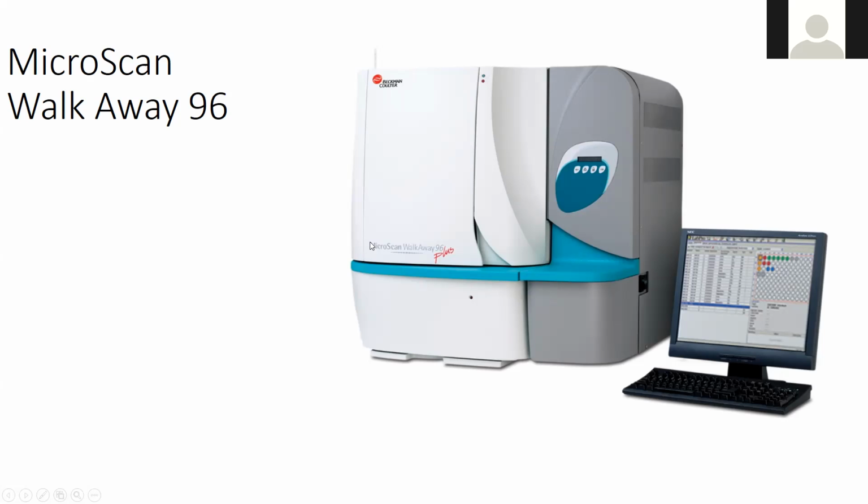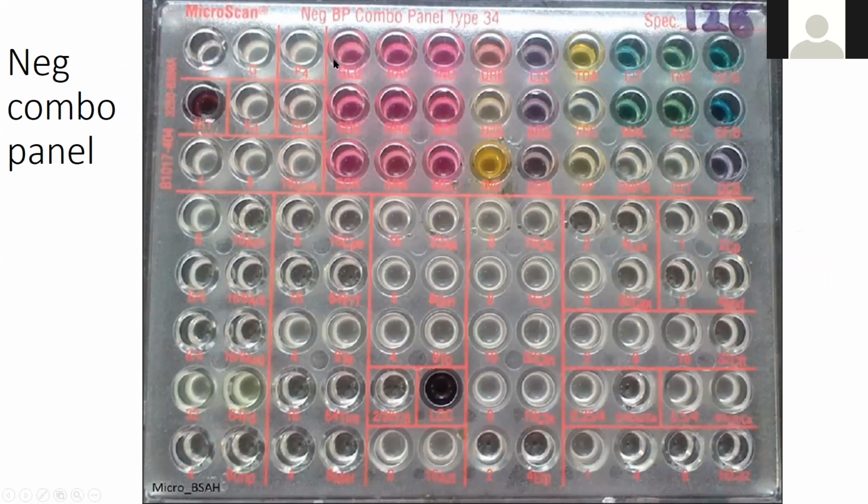So you don't have to pull them out and add a drop of indole and a drop of nitrate. So you're very familiar with this panel. Except the one we did get, the combo was not there, but you get your reactions up here, just like the API was, and then you read these levels, and we did that. And then you have a growth well and a control well. Control shouldn't be having anything, but the growth should. And then you see your different antibiotics. There's your nitrites over here.